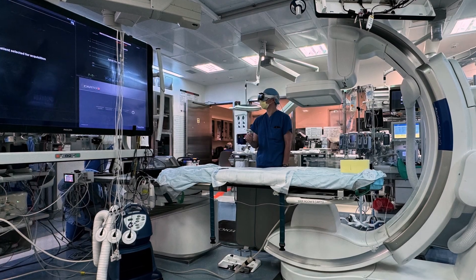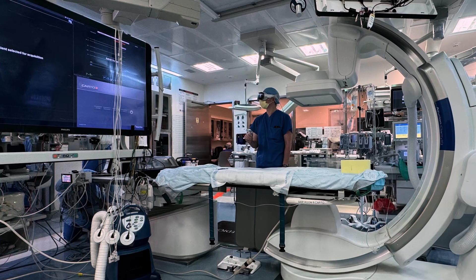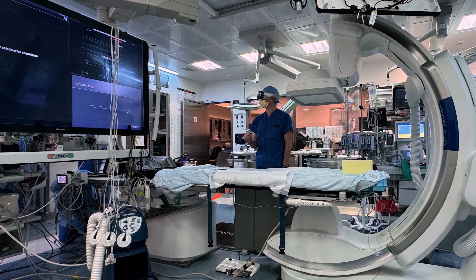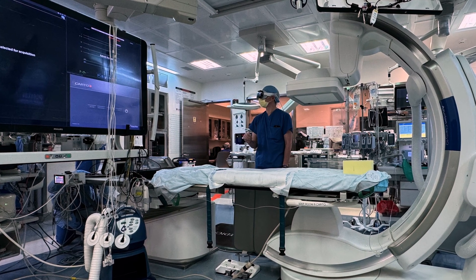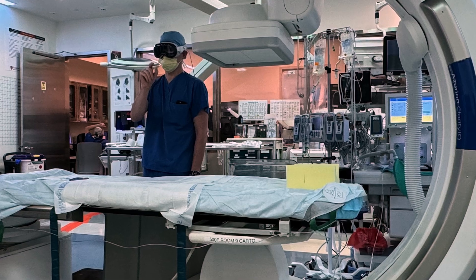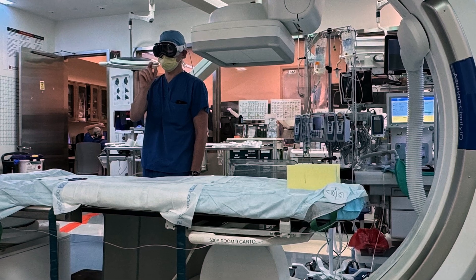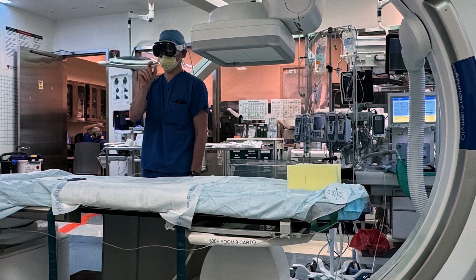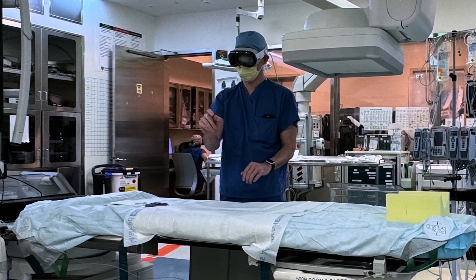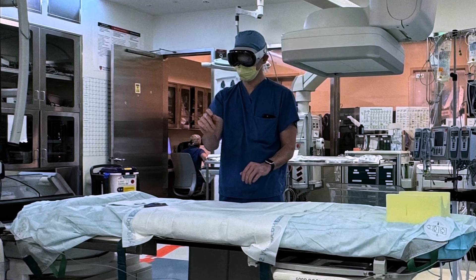There aren't ethical concerns about bringing in a new 4K monitor with higher depth than what we currently have — it's just that it's projected inside a spatial computing headset. We're hoping to add an additional layer where you can not only move the screens but actually reach in and touch the data itself.